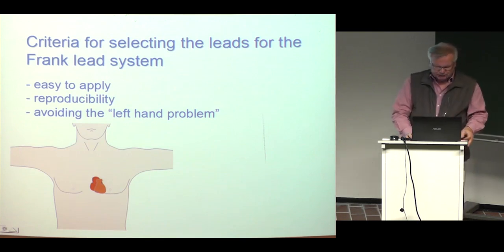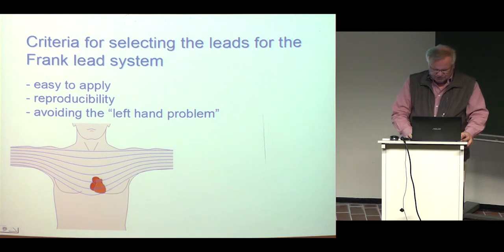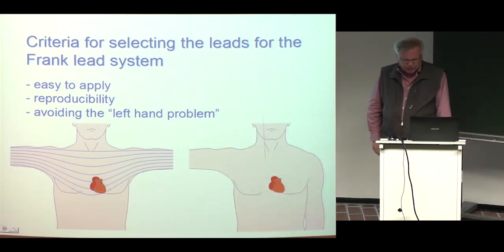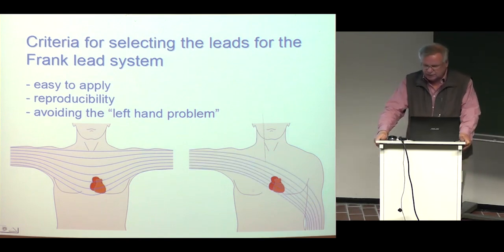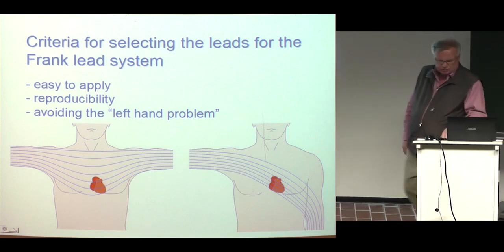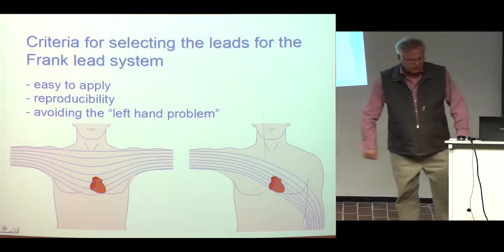The left-hand problem is that if you think of recording lead 1, the lead field looks something like this in the region of the heart. But if the patient lying on the table happens to keep the left hand connecting to the left side of the body, and the skin is a bit wet, then the lead field actually flows like that. You may see that it is no longer lead 1, it is more like lead 2. So that is an important issue: when ECG is recorded, the patient should not have hands touching the sides.